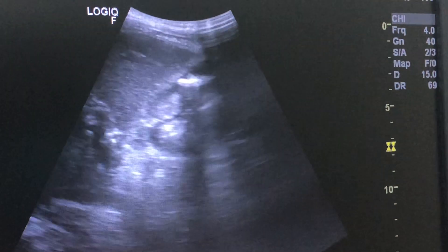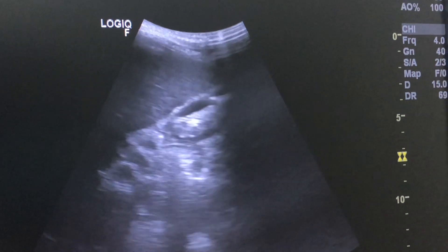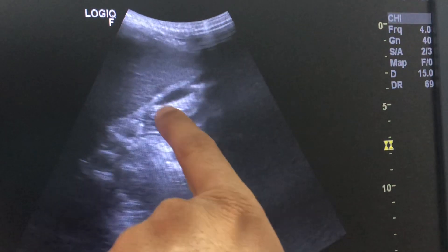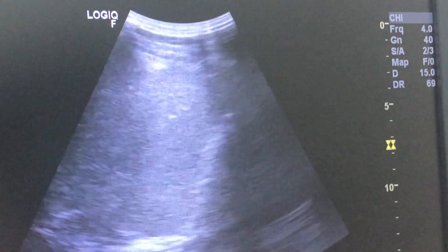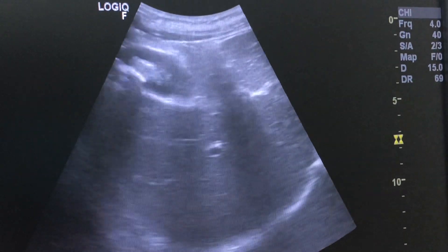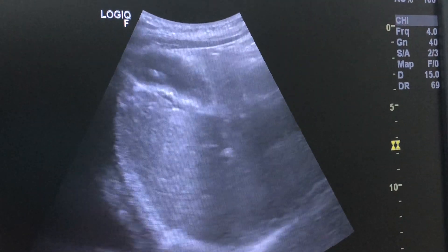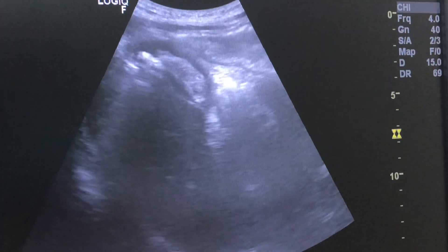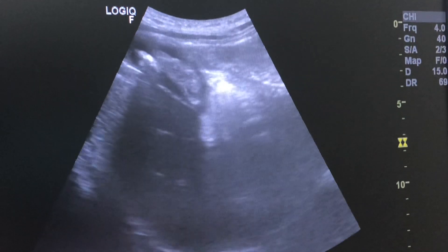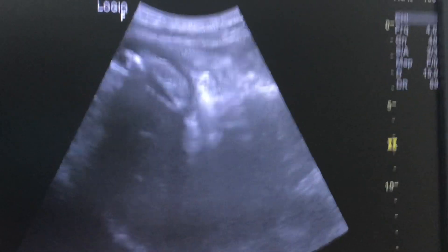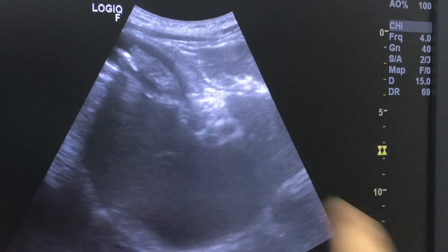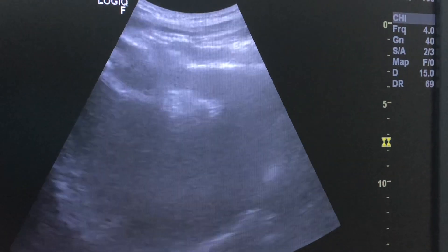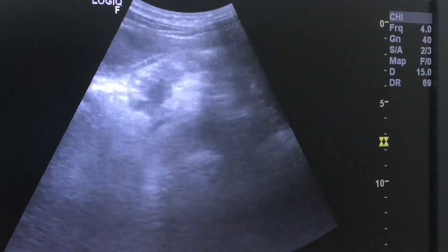The possibility of sludge is more likely because the wall of the gallbladder is not so much affected here. This is sludge. If there is a gallbladder mass, then there could be some alteration in the bladder wall also. And second, this mass is not showing any connection with the inner wall mucosa. So the possibility of sludge is more likely.